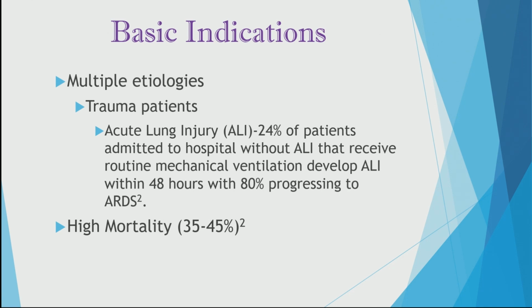I did a lot of literature search and resources here, and the answer is no. However, I will add this: APRV has been shown in several studies to statistically affect, for the better, the oxygenation status of patients if applied early.